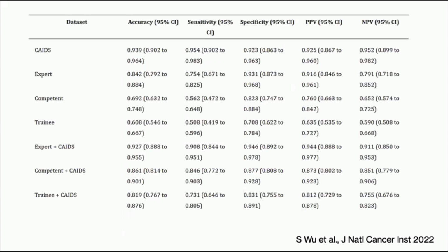And they actually use it to compare to urologists, either expert urologists, new grads, or trainees. And what they did was they provided each of these groups with a subset of what they defined as 260 complex images, which were not obvious tumors. So there were examples of things like inflammation, carcinoma in situ, small tumors, scars, lots of things that could potentially be borderline cases and are historically more challenging to determine for even the expert urologist.